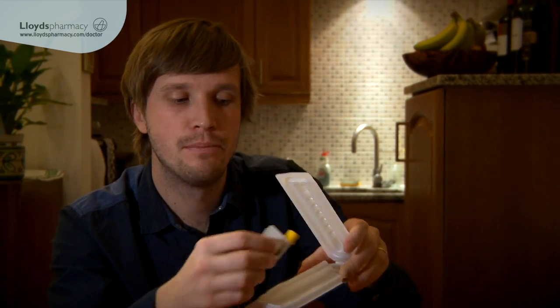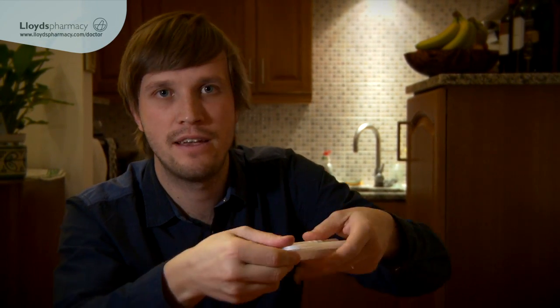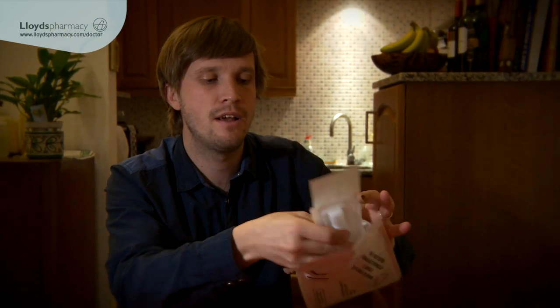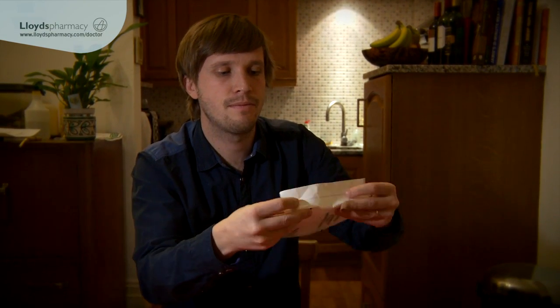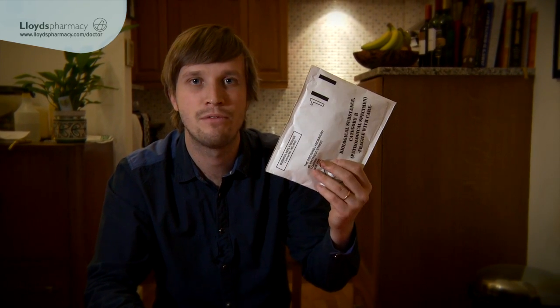I take the labelled collection bottle and put it into the protective casing. Along with my request form which I've already filled out, I place it into the prepaid envelope. Seal up the envelope, and now it's all ready to send off to the labs and wait for my results.